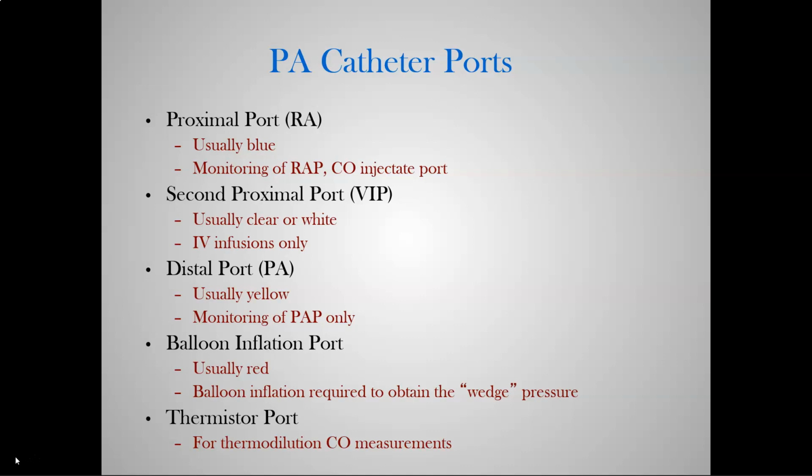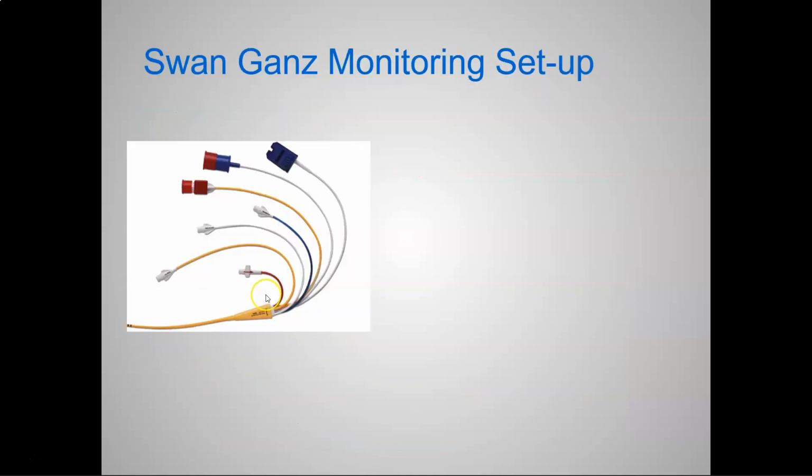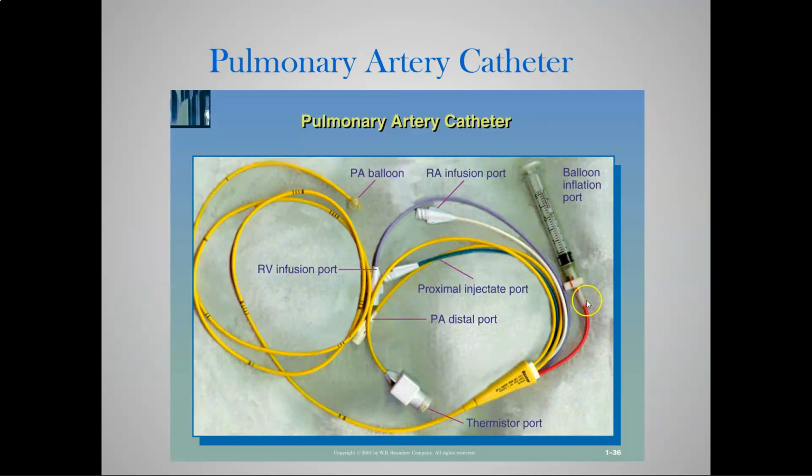And you saw it earlier. Scroll back. Oh dear, come back. There it is. Notice how it's this little short red line, and notice how it even has its own stopcock built in. By the way, these syringes typically come with the kit, and they typically are limited to the exact amount of mLs allowed in that balloon.